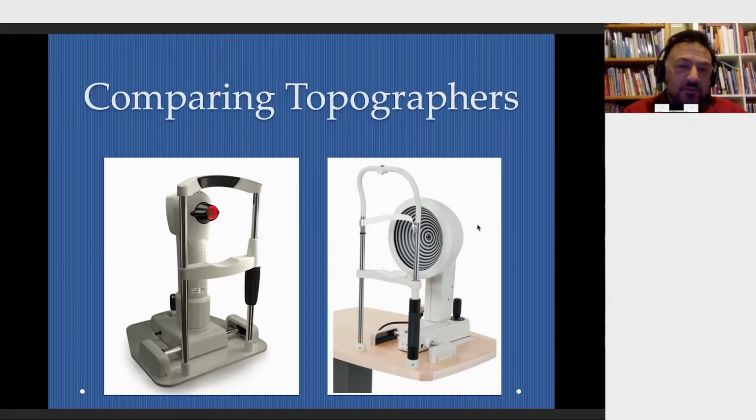The Keratograph works great for baseline corneal measurements and screening before we begin a fitting. And the poll question I was going to ask you today was, what percentage of your patients do you do corneal imaging on prior to beginning a lens fitting? We do them on everybody, partly because we want to obtain information about eye shape and how it will impact our fitting, but also because we want to have baseline information to check for pathology or subtle problems before we begin the process.